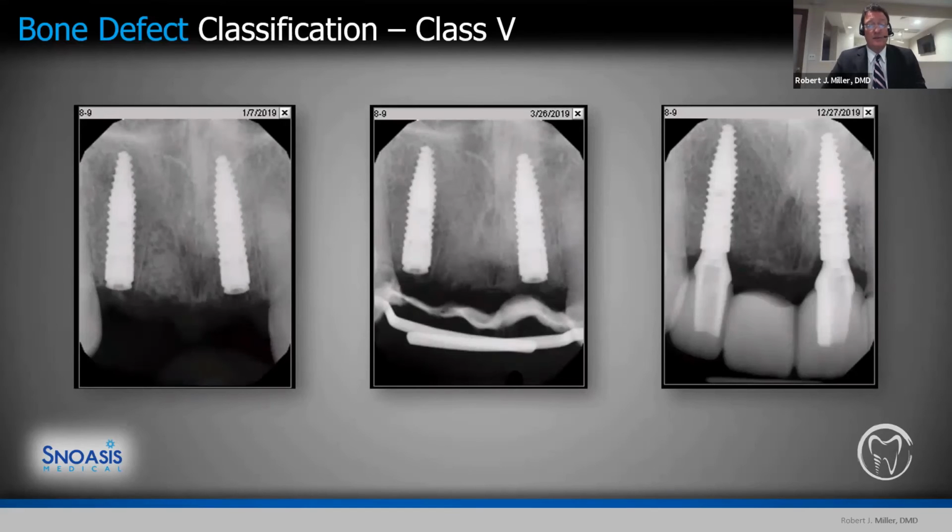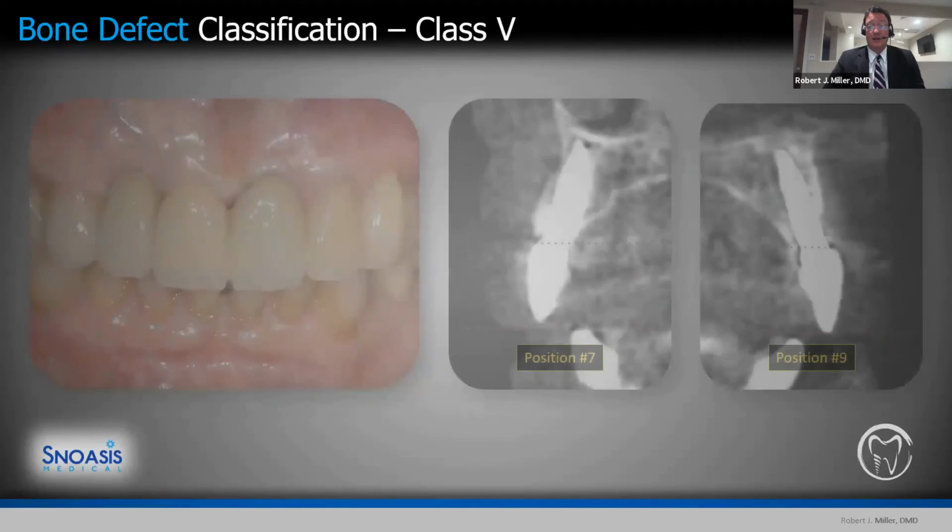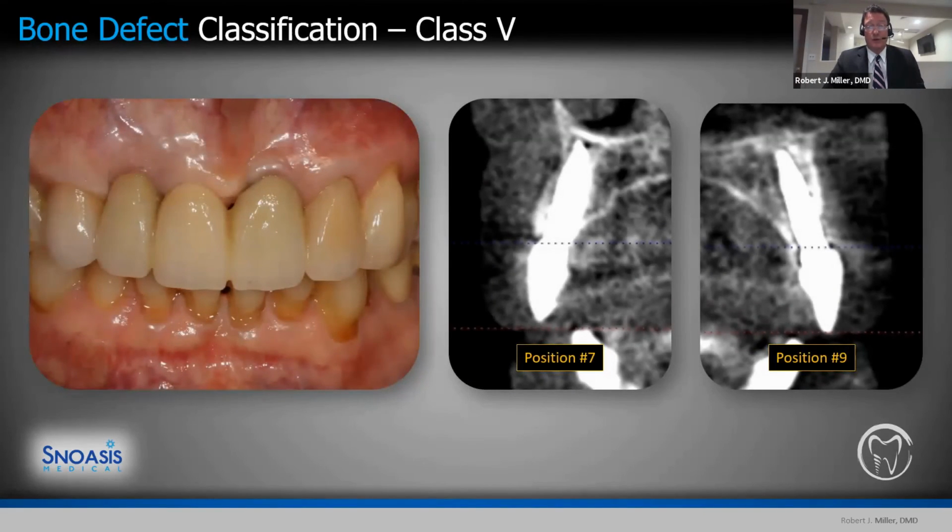You can see in January, this is January 2019, is when the procedure was actually performed. She had left for Philadelphia. She lives in both Philadelphia and South Florida, so she wound up having it restored up in Philadelphia. She left for Pennsylvania in March and then had it restored over the summer. Ultimately, I saw her in December to see the case in its final stages after being restored. And this is the final prosthesis, a fair result.